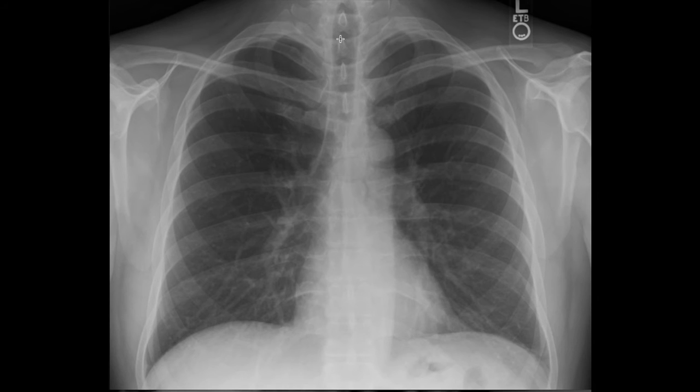And the second is rotation, and that's the crucial aspect, because rotation in the chest can change its appearance. Rotation is indicated by the rotation of the thorax or the chest around its axis within a certain degree, and that's seen in the distance between the clavicle and the sternum, in the sternoclavicular joint right here. The left sternoclavicular joint space should be equivalent to the right sternoclavicular joint space. The spaces have to be equal to each other. If one is bigger than the other, then there is rotation towards either side.